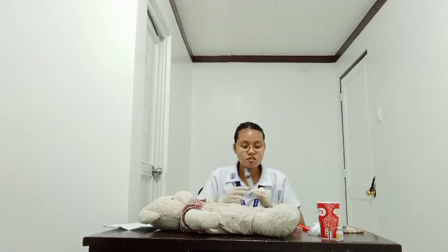Now, use the ulnar side of the non-dominant hand to pull the skin approximately 2.5 centimeters to 1 inch to the side. Under some circumstances, such as for an emaciated client or an infant, the muscle may be pinched. Now, hold the syringe between the thumb and forefinger as if holding a pen, just like this. Pierce the skin quickly and smoothly at a 90-degree angle.